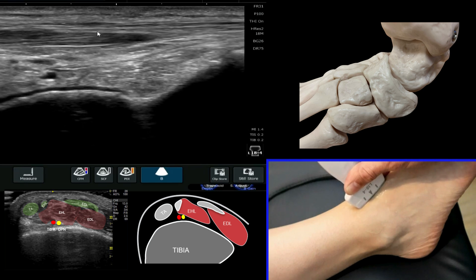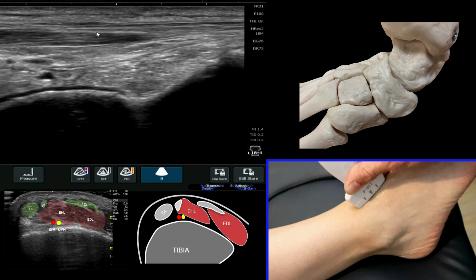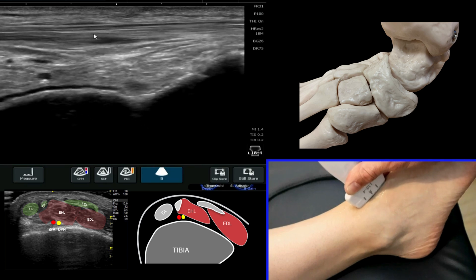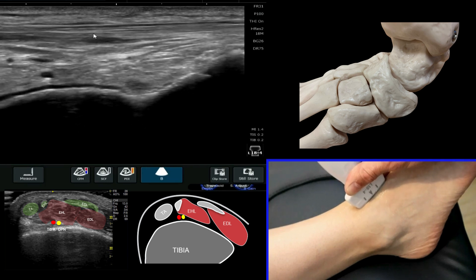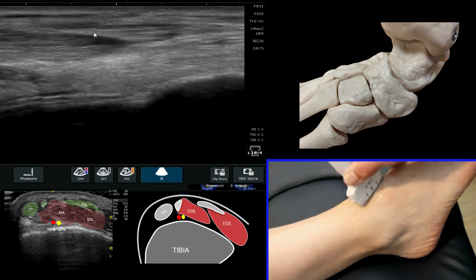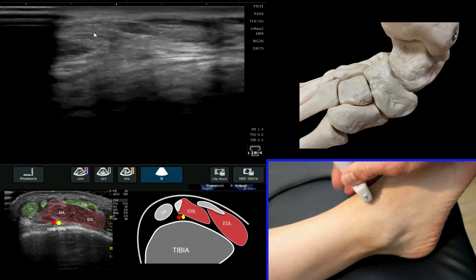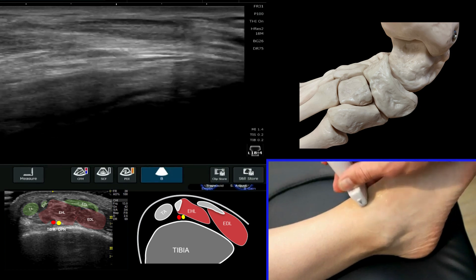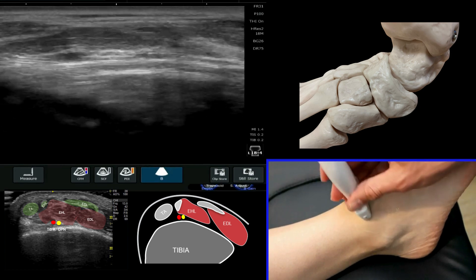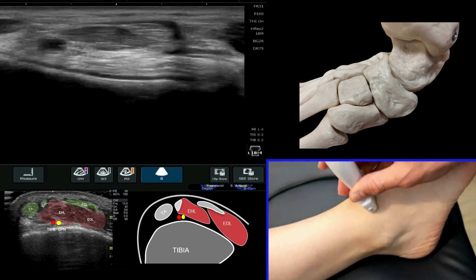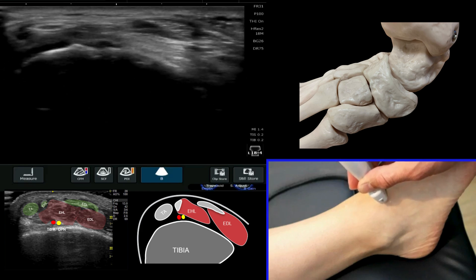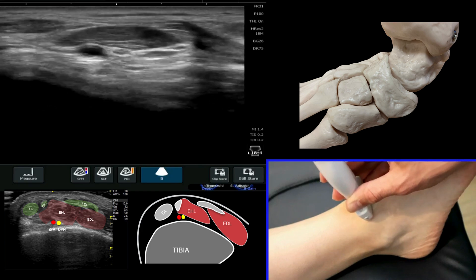If we ask the patient to gently wiggle their toe, you'll see it move nicely. Coming back around, we've got tibialis anterior — just get your bearings — and there's EHL.